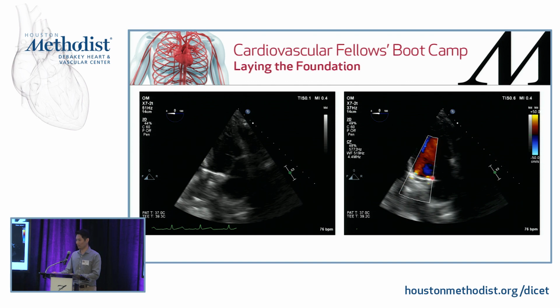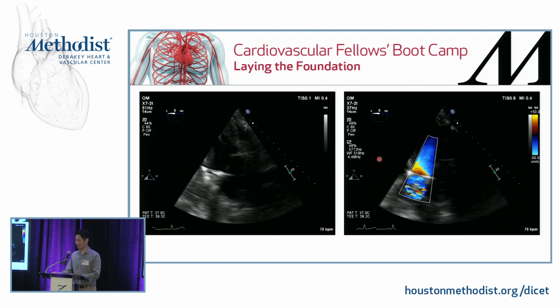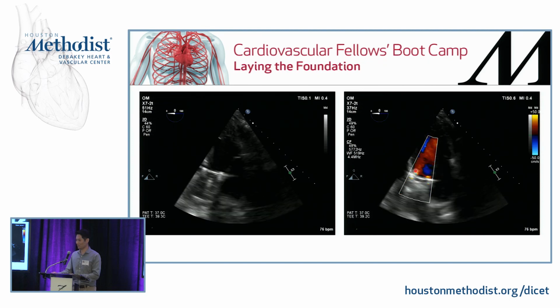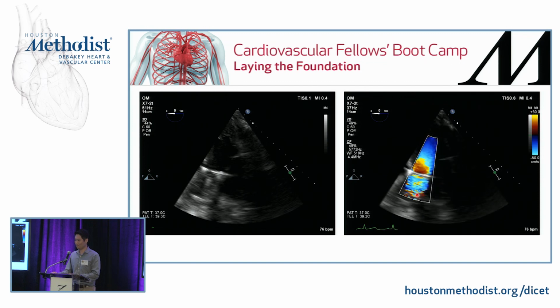And over here, it looks like there's some regurgitation, but since that's coming from inside of the ring, it's most likely to be a washing jet. So you see that? You got some washing jets over here, coming from inside of the ring. So far it looks okay, right? So we told that to the surgeon.